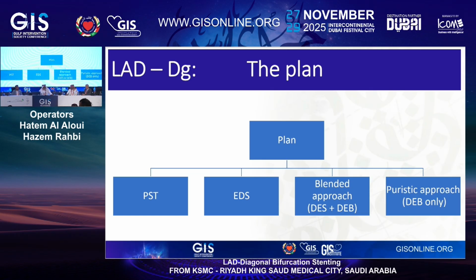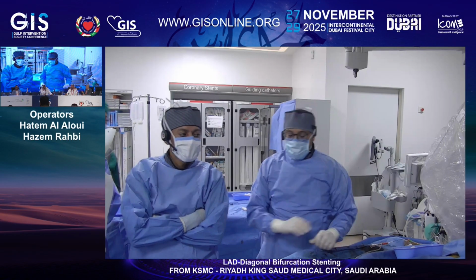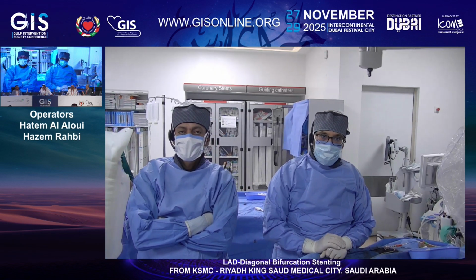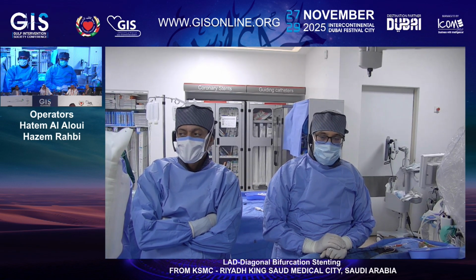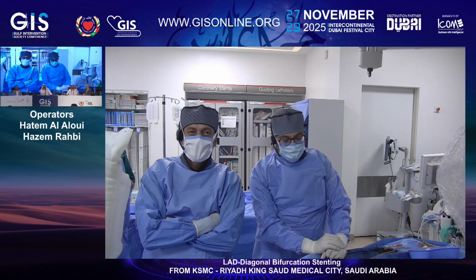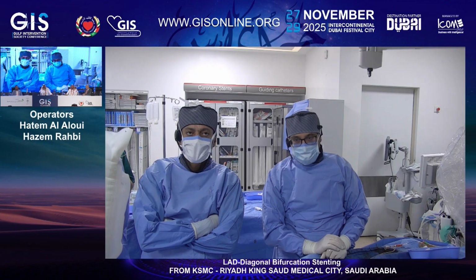This looks like a very interesting lesion to treat. It looks simple, but it's not as simple as we might imagine, because we have a significant lesion in the LAD, obviously, and we have a sizable diagonal branch that is diseased with a quite long lesion. So we might consider to stent upfront that diagonal lesion.